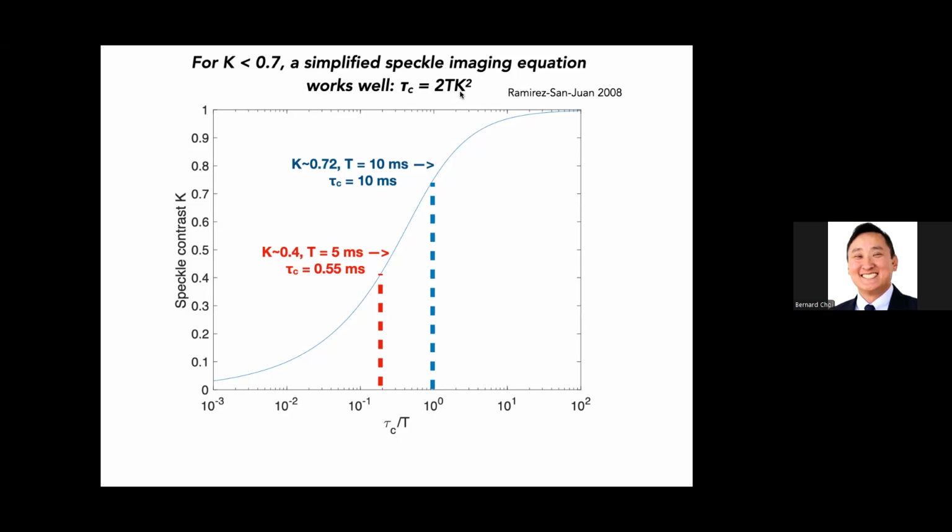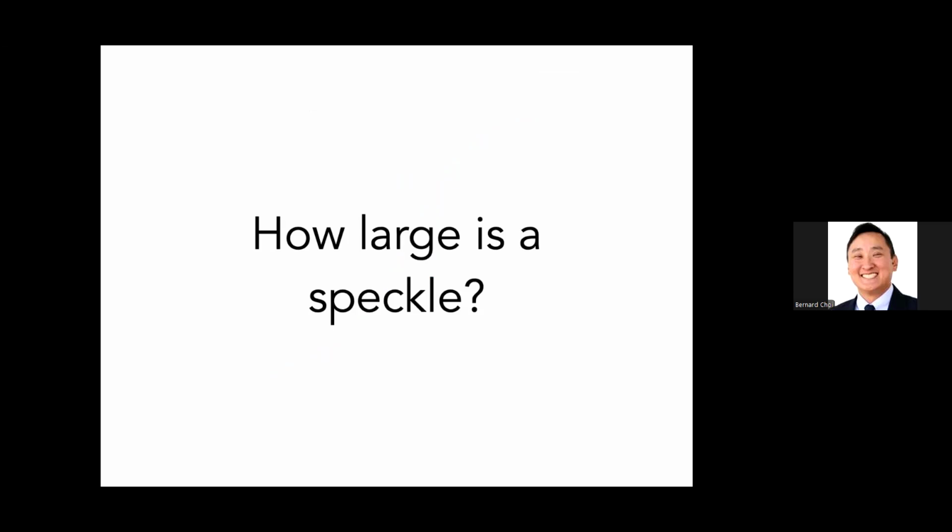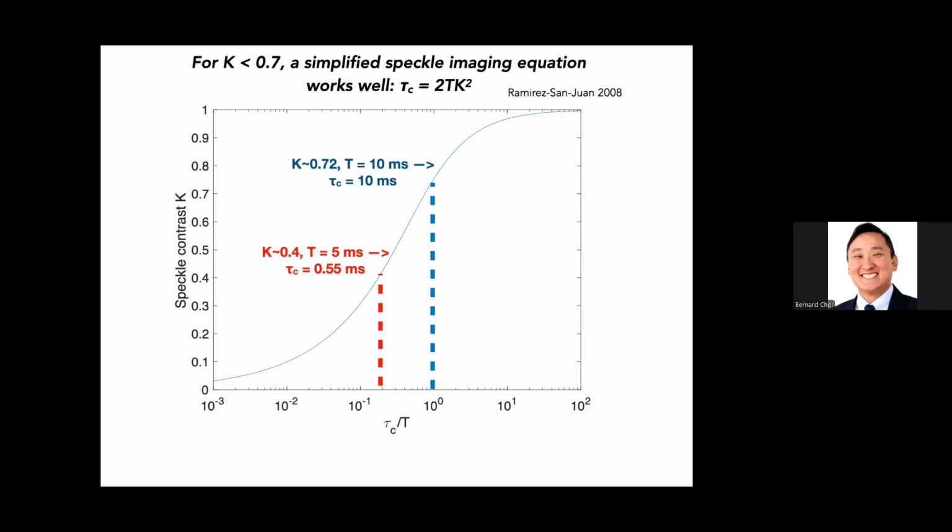So if you have GPUs and things like that, you can parallelize the contrast calculation, and this is trivial to calculate for a computer. So you can go real time. That's what Christian was showing. He didn't show the video, but we can show it, probably not without the recording. Okay, any questions so far?